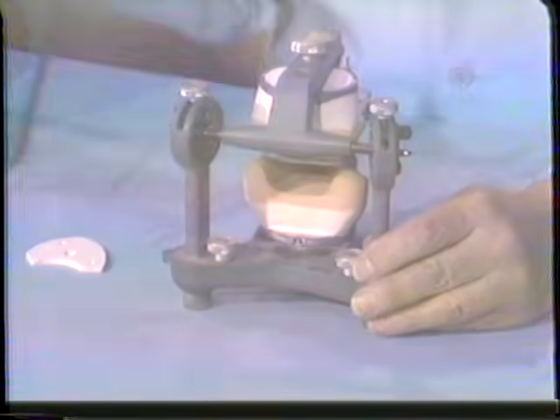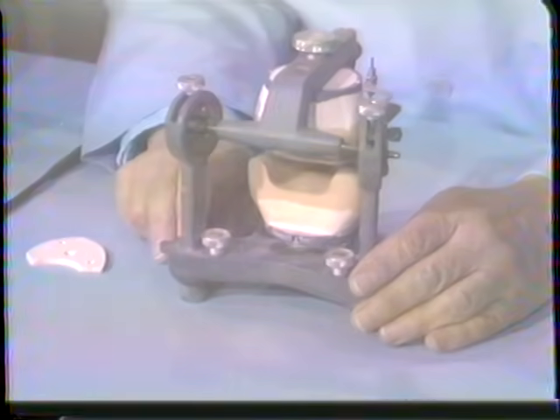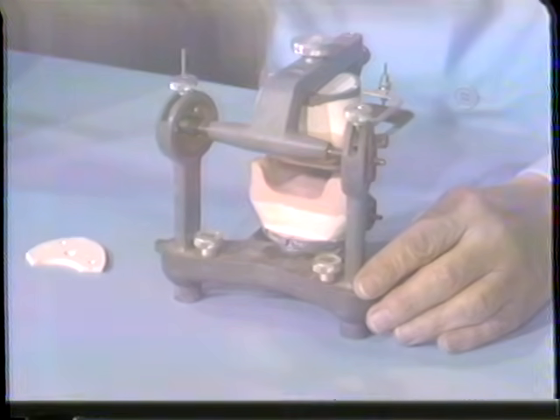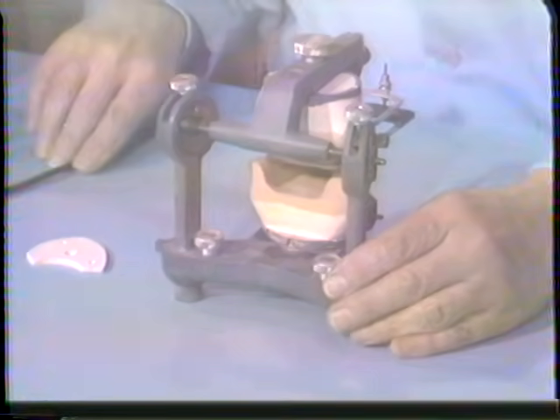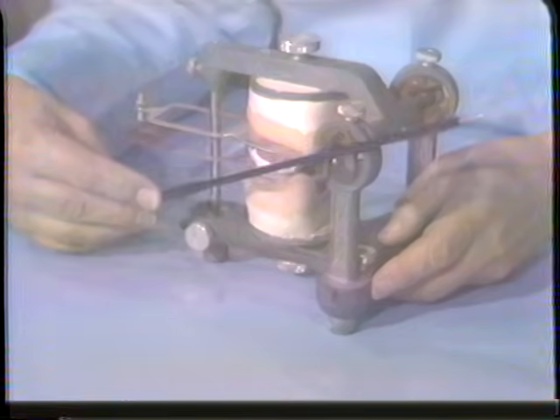The lateral movements are simulated. Why? Because these positions are fixed. These elements are fixed. We cannot move them in or out. Therefore, we cannot accept anything beyond a protrusive record for most individuals. This is the one I spoke of earlier in terms of facebow transfers, which is set to about 110 millimeters as far as the distance between these elements. This gives you a little bit more information now, though, more individualized for each patient, when we do set the condylar inclination for these patients with the protrusive record recorded on the patient.